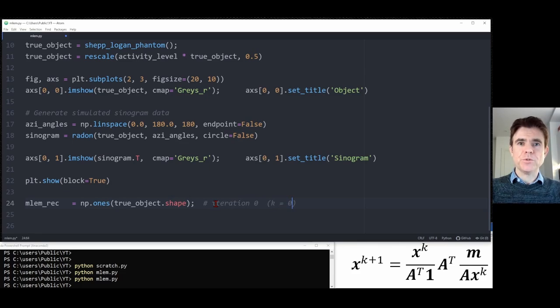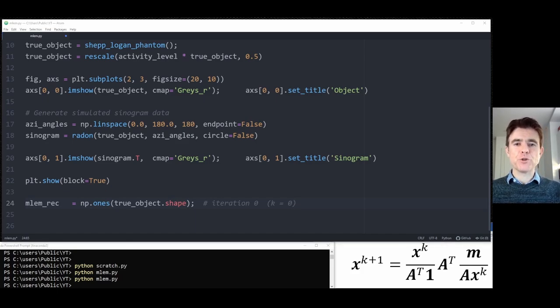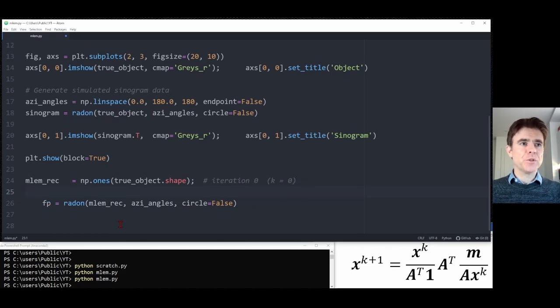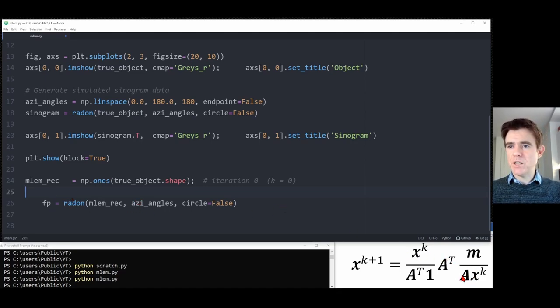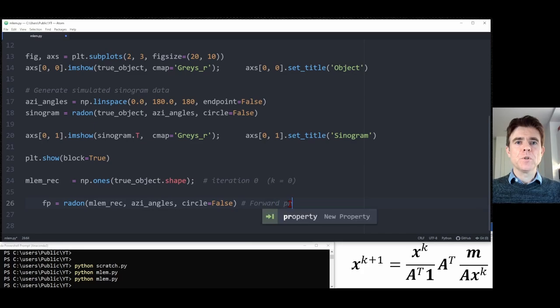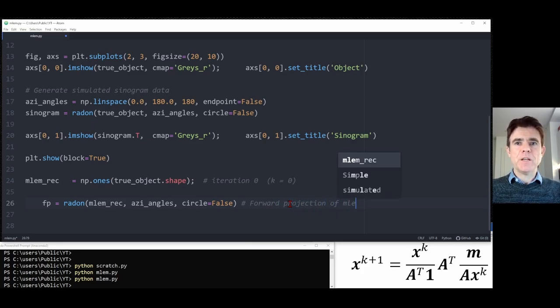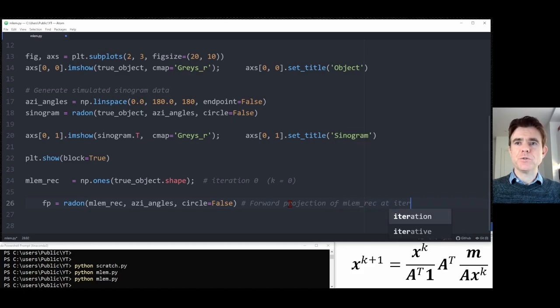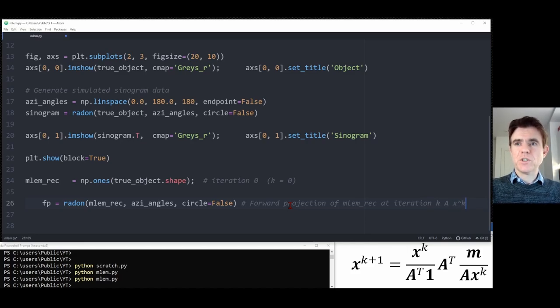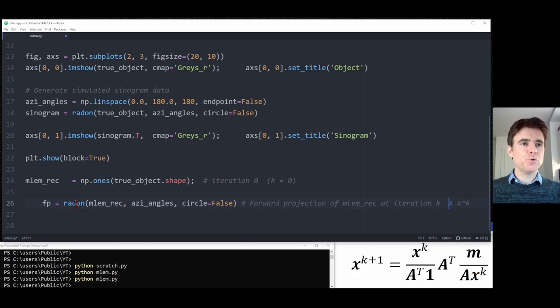In each iteration, we first forward project the reconstruction. I indent that because we'll be looping over it in a second. This is Ax^k — the forward projection of the MLEM reconstruction at iteration k, corresponding to Ax superscript k in the formula shown in the bottom right-hand corner. To implement this algorithm, we take the measured sinogram data and divide it by that forward projected image.